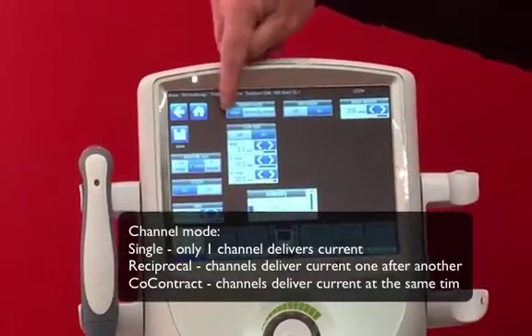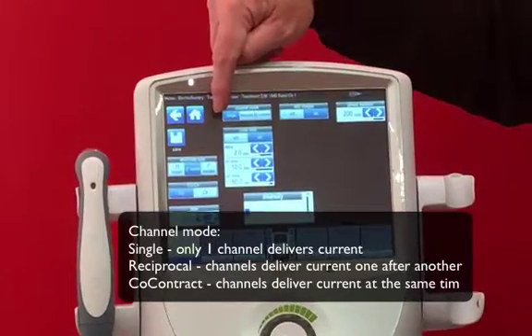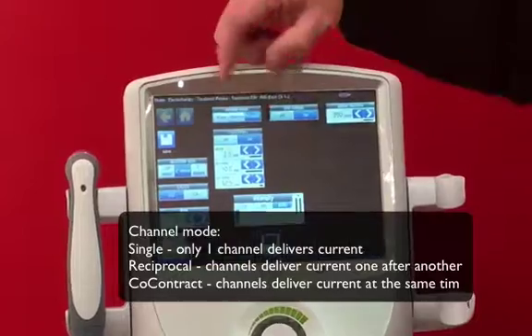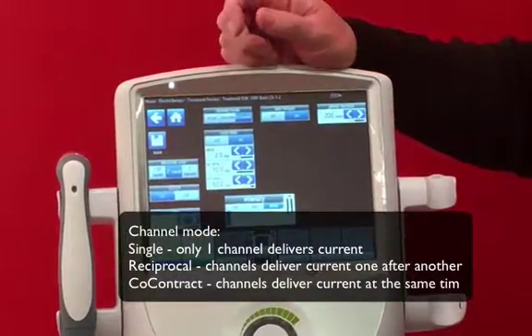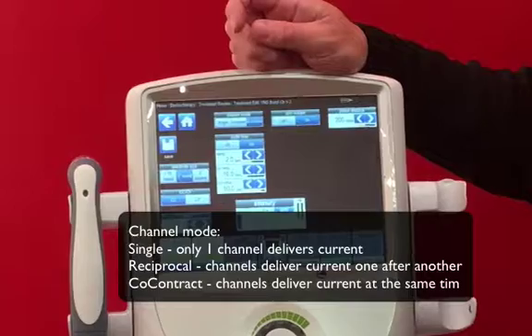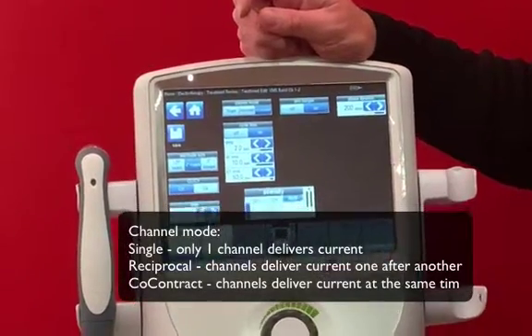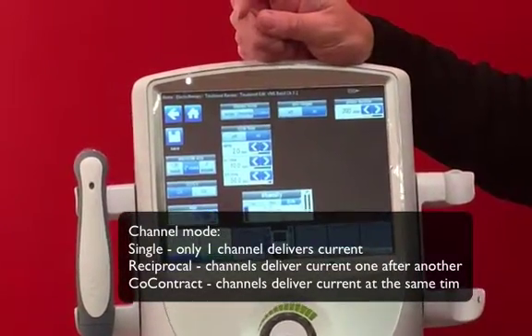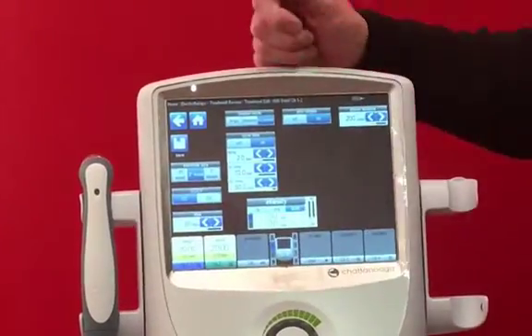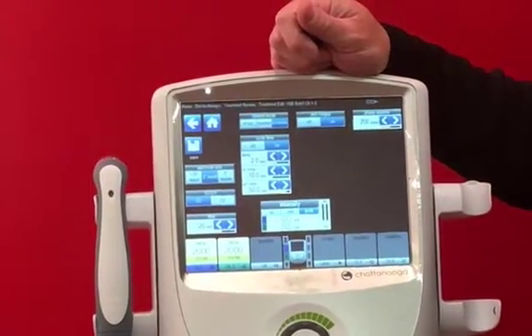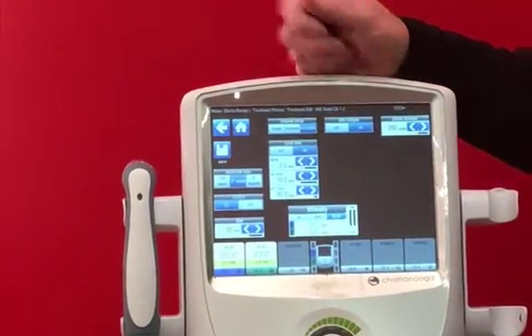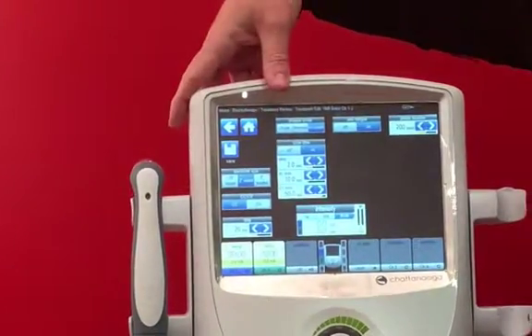Channel mode defaults to single channel, but we can set two channels — either reciprocal or co-contract. Reciprocal means both channels will contract sequentially, whereas co-contract means they contract simultaneously. You can set the intensities together or differently depending on the size of the muscle groups and how they interact in terms of opposition.